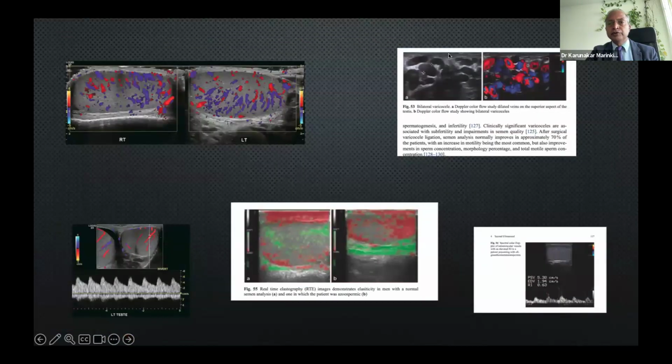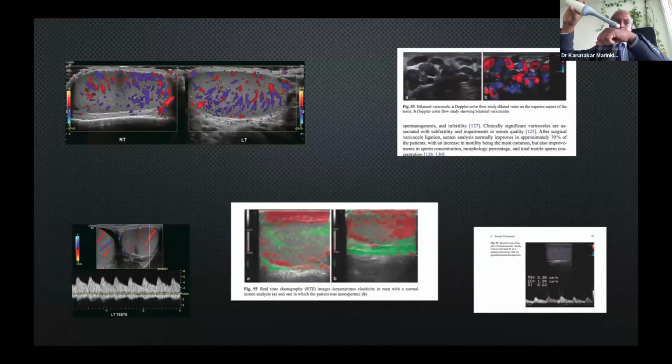A vein, which you will easily see just below, is almost like a subcutaneous vein. You can see your own veins there. You just put a probe, and you're able to see. You don't need a TVS probe for that. You just need an abdominal probe. You're just spreading over, and you will see the veins like that. That's an abdominal linear probe. You just see it. You will see the veins exactly like this. The veins are more than 3 millimeters with or without Valsalva.